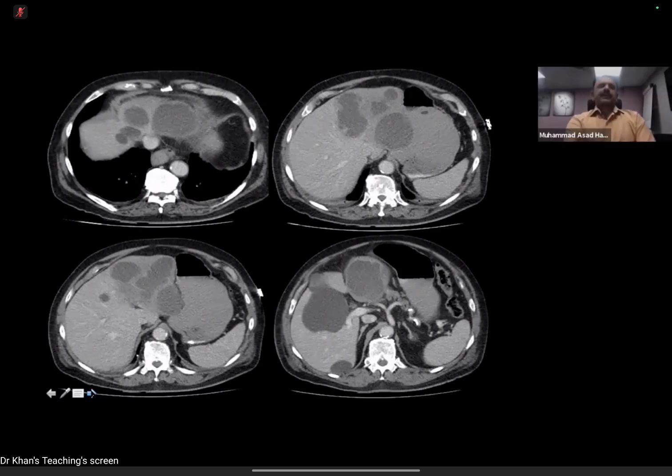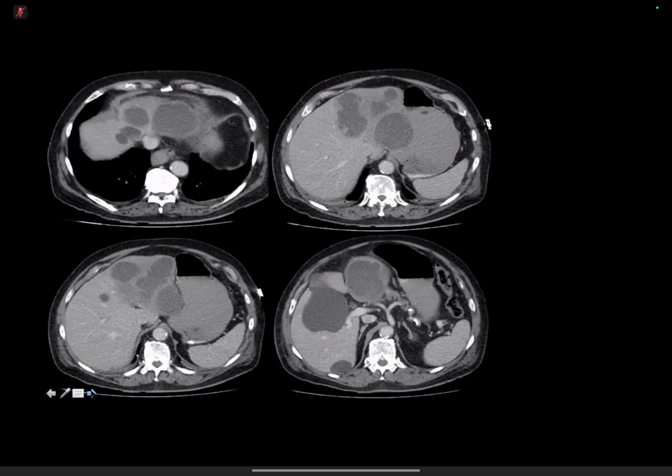Good. Now, the examiners then normally ask, can you please describe how do you perform the drainage? So just looking at the CT, it looks like these lesions would be accessible through the anterior abdomen. They don't seem to be overlying bowel or other structures, and luckily they're not high up within the right lobe.